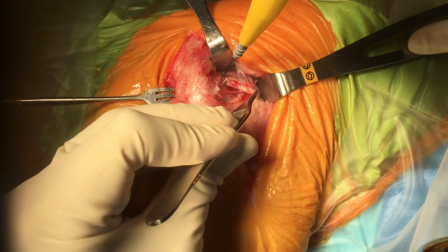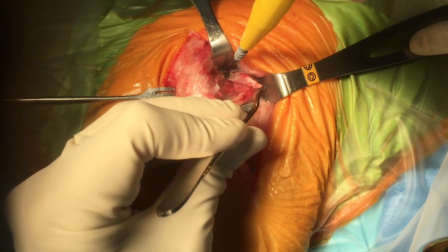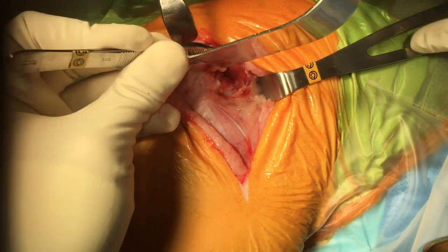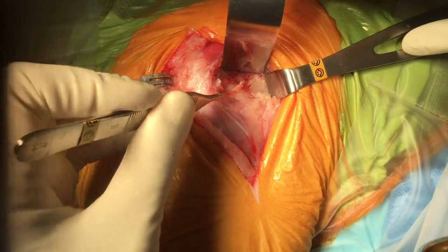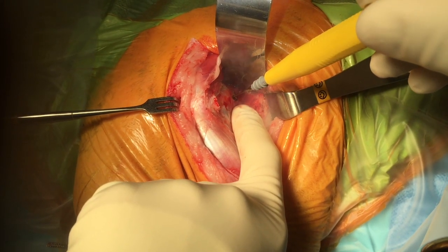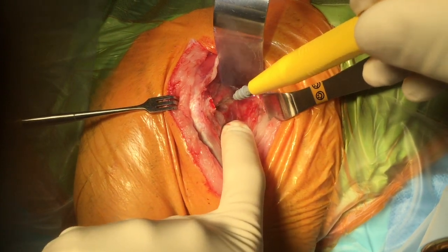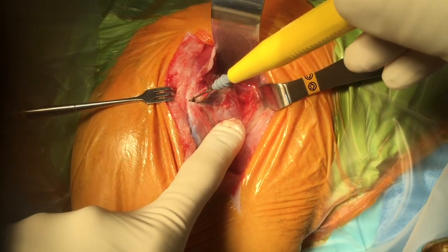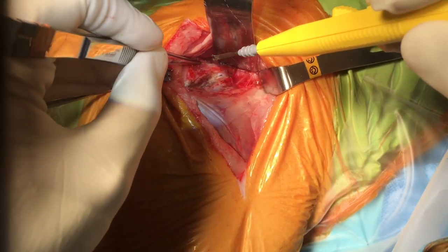The tenotomy begins with a transverse incision, followed by an incision running parallel with the fibers of the muscle going dorsally. The deep gluteal muscle flap is then reflected cranially and retracted dorsally with a retractor.